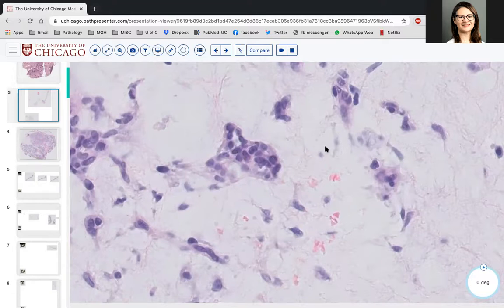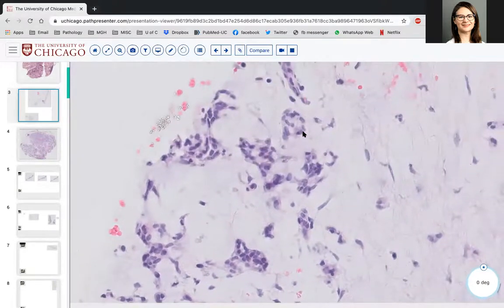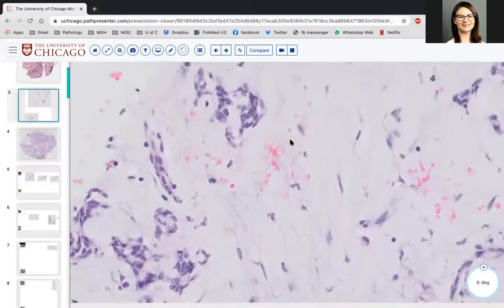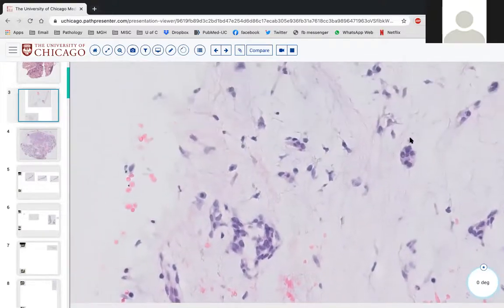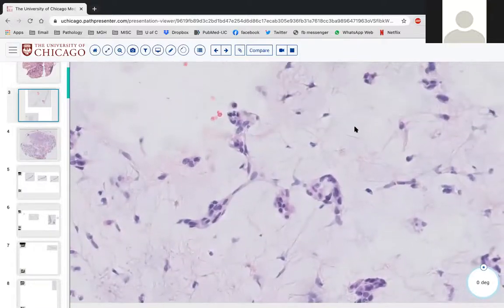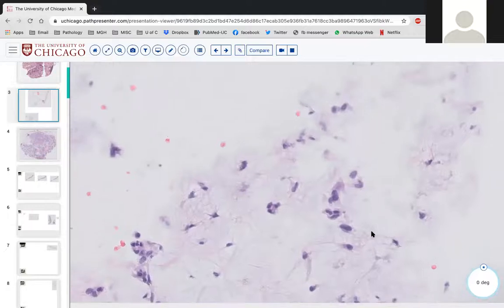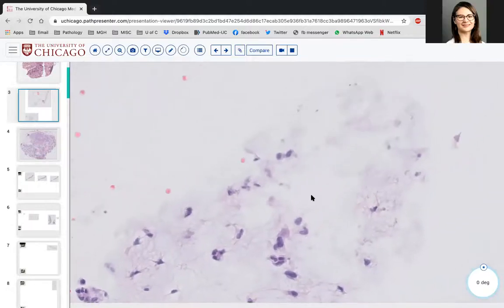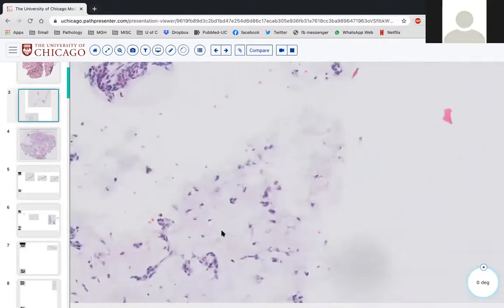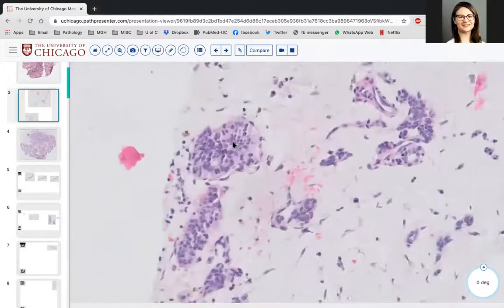Whereas stromal mucin is produced by, like you said, more of the myoepithelial cell population and extruded backwards out into the stroma. Yeah, right. I don't see it clearly within the cells, so I would say it leans more towards stromal. Obviously, if you did PASD stains and saw positivity within these cells.